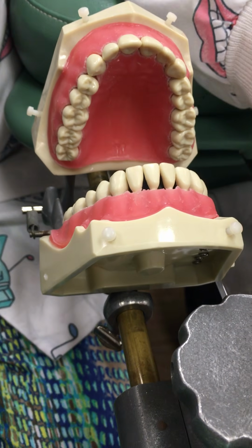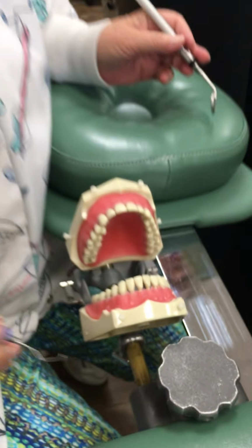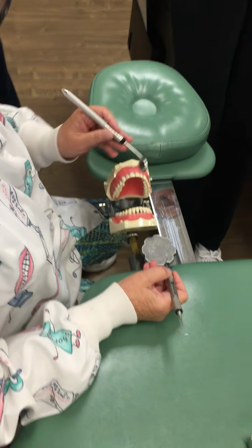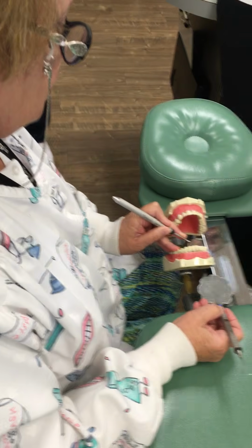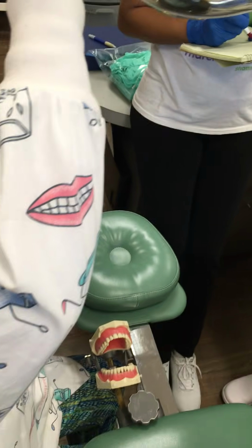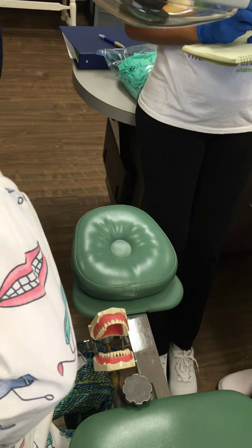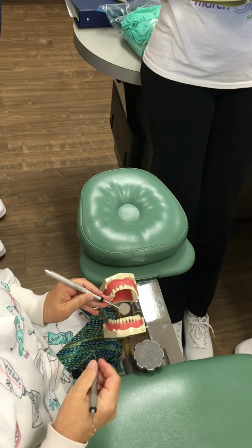Okay? So now we've done toward and away in the area 1, the labial of the anterior. All right? So for area 2, we're going to come back to the toward direction, and we're going to place our mirror in now, and our light would be coming straight over and pointed straight down into the lingual and onto our mirror.